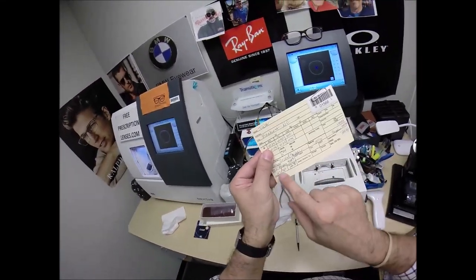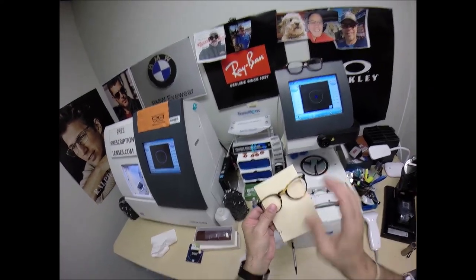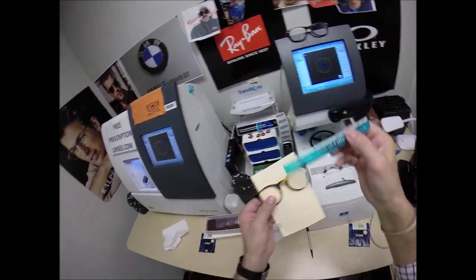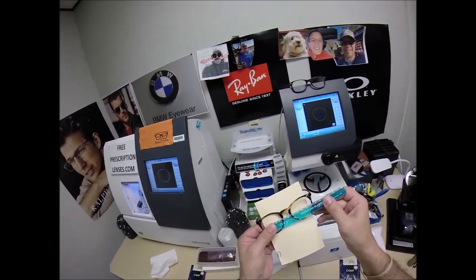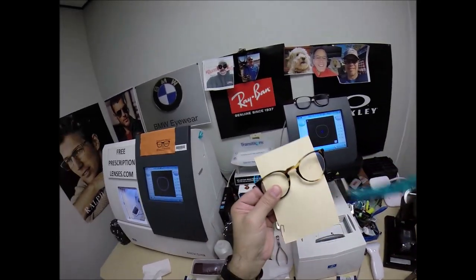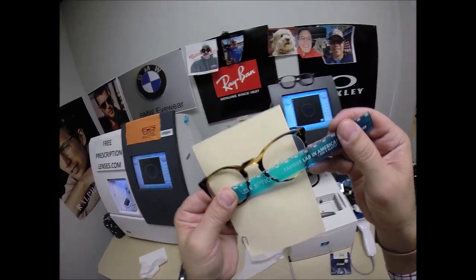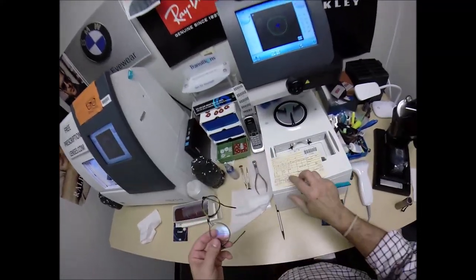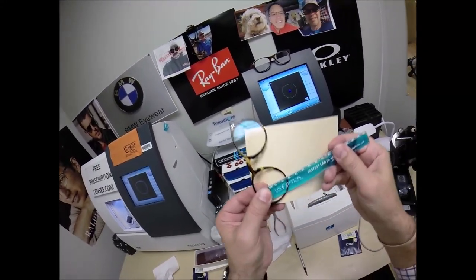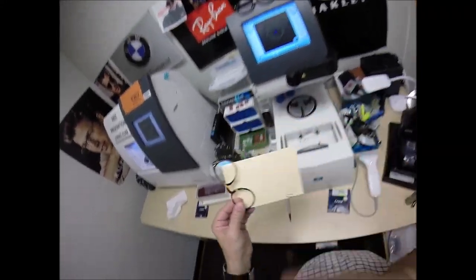Your pupillary distance: 27 for the right eye, 30 for the left, or a combined 57. Take the blue PD stick, and when we hold it up to the left lens — look at that little singular black dot — we're getting 57 millimeters, so that is cut perfectly. Let's check the optical center height of 24. Turn the card around, and when we look at the center of the bottom of the frame, we're getting 24. That kid is good.